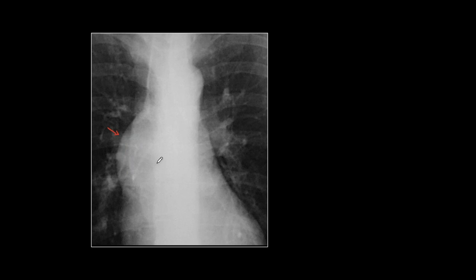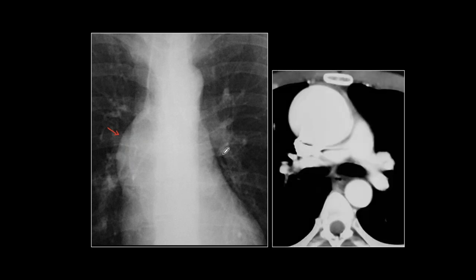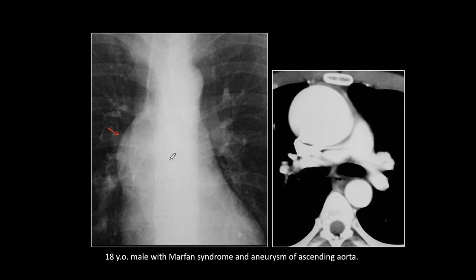The findings are very monotonous, but when we do a CT we see a large dilatation of the ascending aorta and a normal descending aorta, as we suspected from the plain film. This is an 18-year-old male with Marfan syndrome and an aneurysm of the ascending aorta, as you know happens in Marfan.